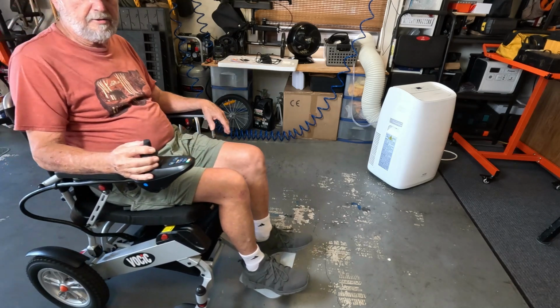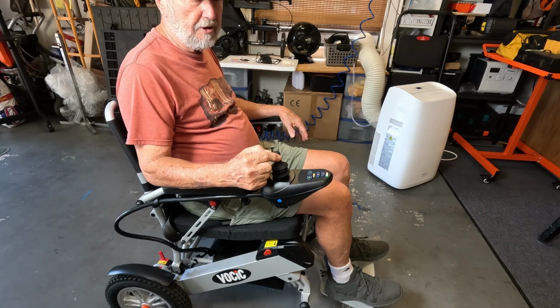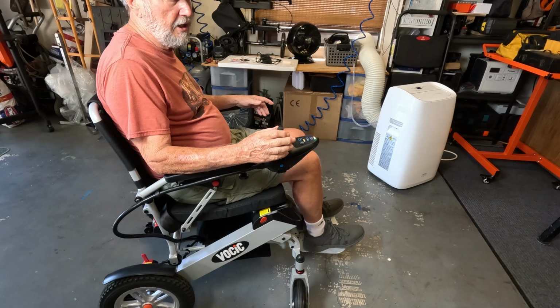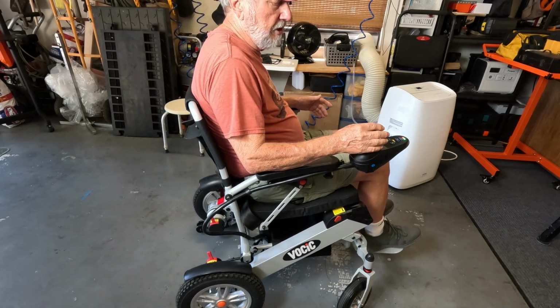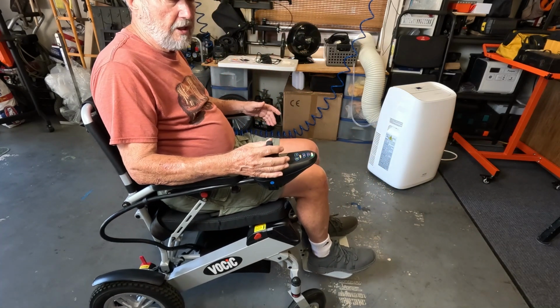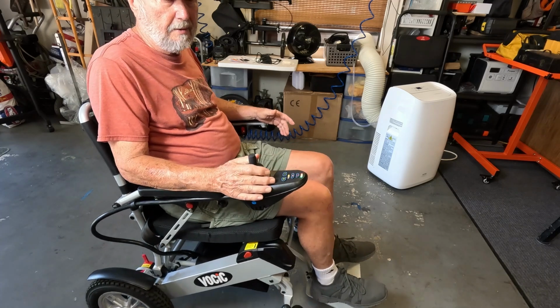And you can see the controller here. I'm just going. And see, if I push it in an angle like that, it goes back and to the left. Push it up and it goes to the angle. And then when you go straight, it can go back straight. You have to really get used to it and kind of just work it a little bit at a time.